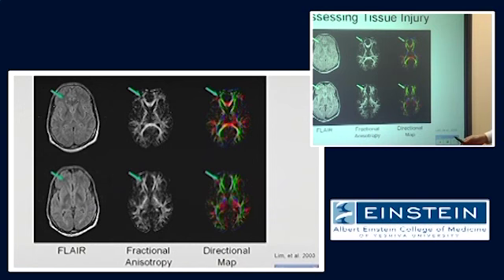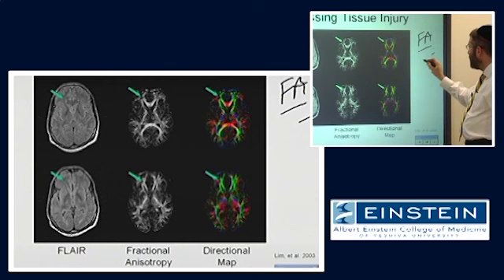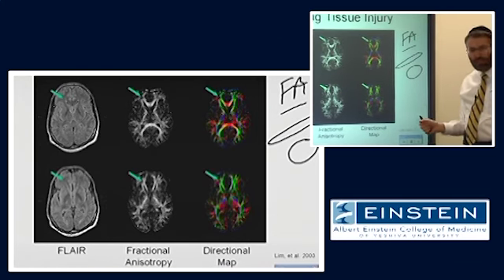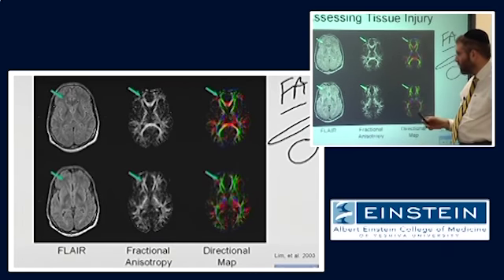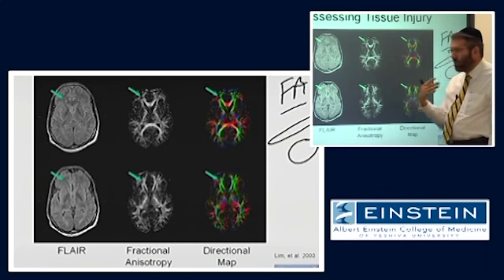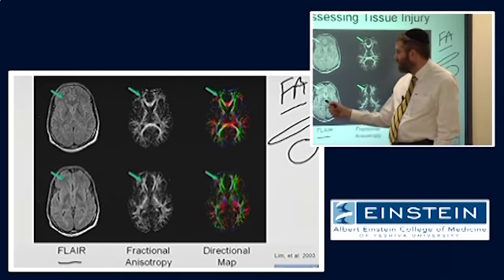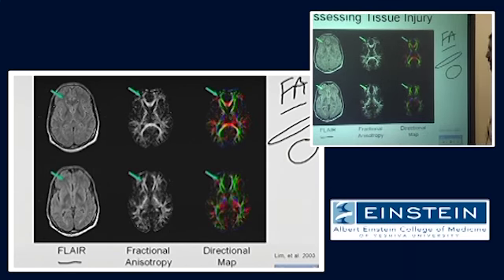how we can use an assessment of the anisotropy, or how skinny or fat that diffusion ellipsoid is, to be very sensitive to the presence of white matter pathology. So this is an example. This is a patient who is a cocaine user who had some problems with performance on certain neuropsychological tests that correlate with frontal lobe function. So here is his typical structural image, FLAIR images. And if you look in the right frontal lobe, you don't see very much going on there.